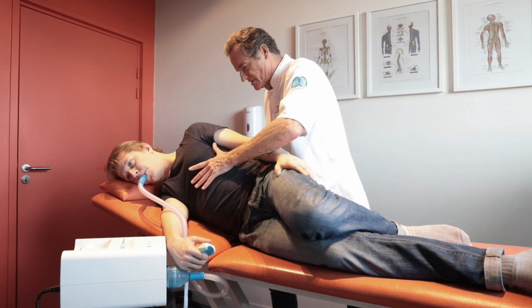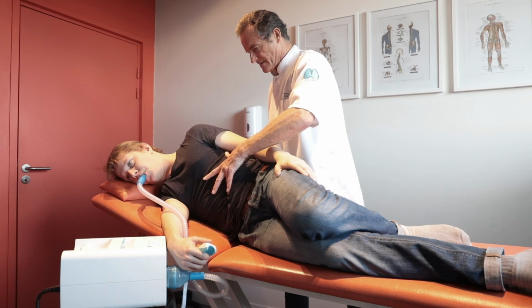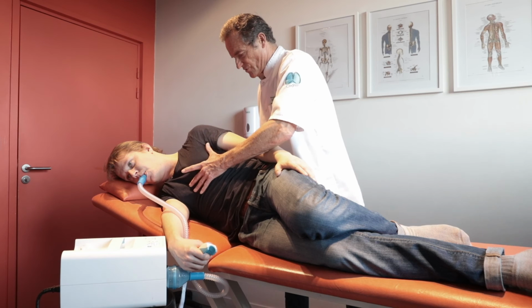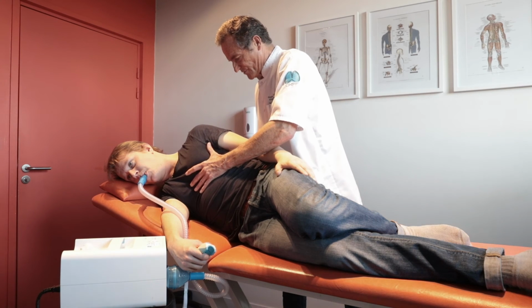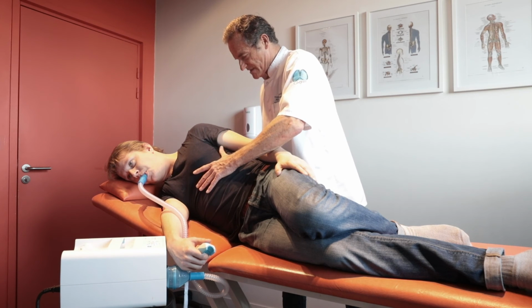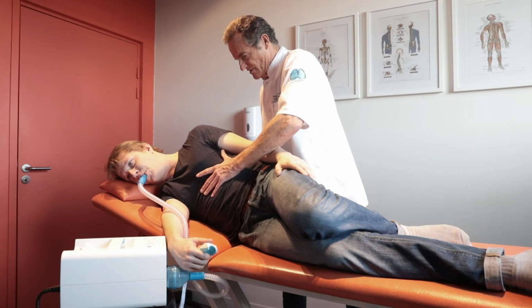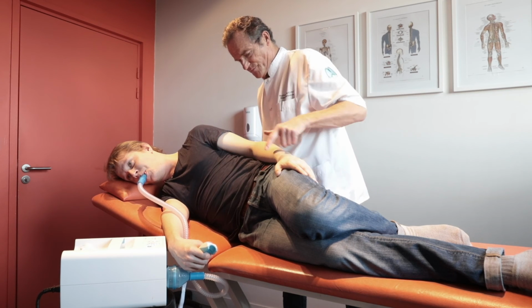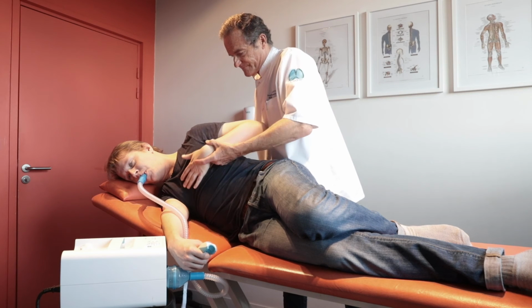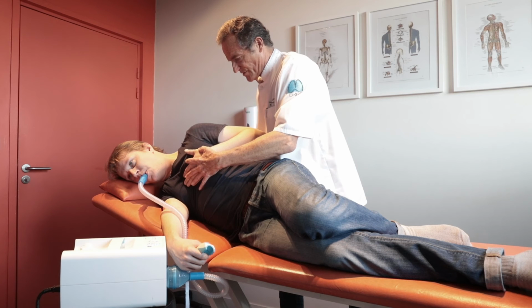The expiration must in no case be forced, but quite the contrary. It is carried out as a sigh with an open glottis, in order not to disrupt the Simiox action on the viscosity of the secretions. The patient must not actively blow into the device. At the beginning of this relaxed sigh, the patient triggers the Simiox. He perceives throughout the duration of his expiration the vibration that modifies the rheology of his mucus and transports it.